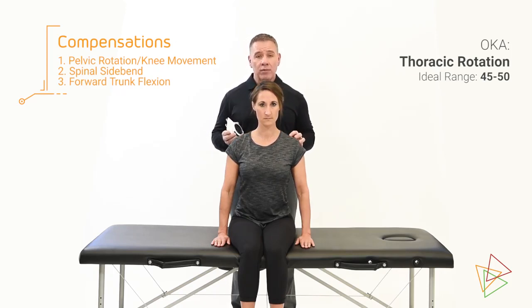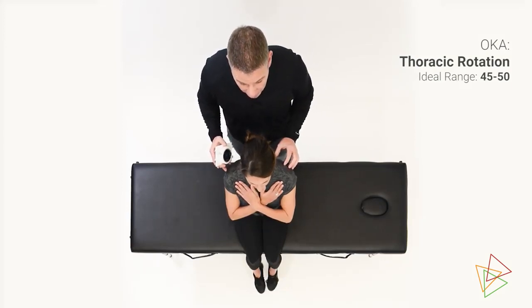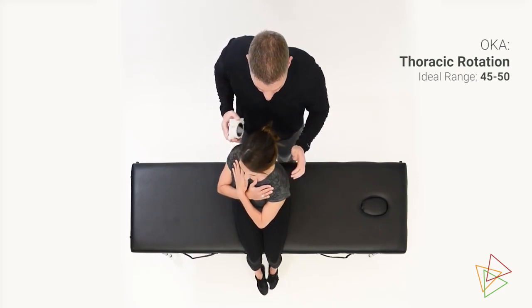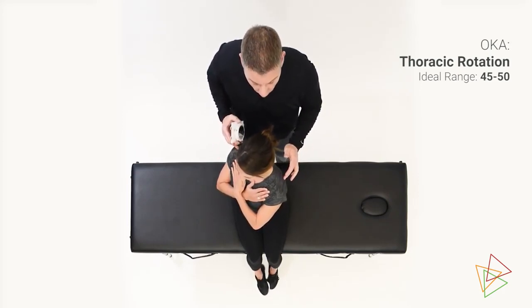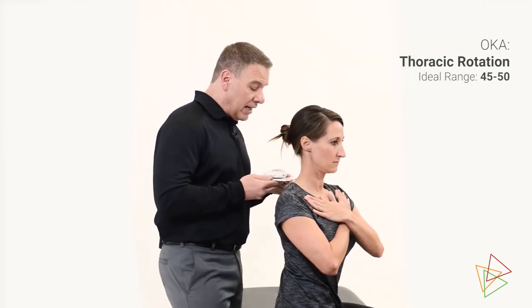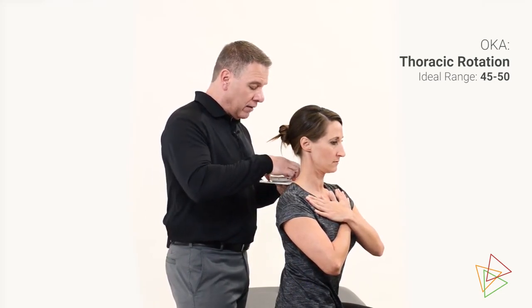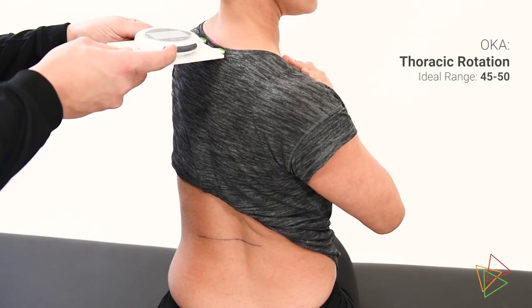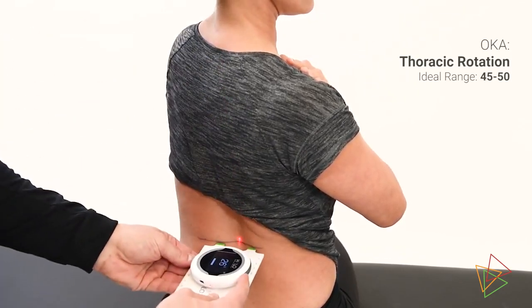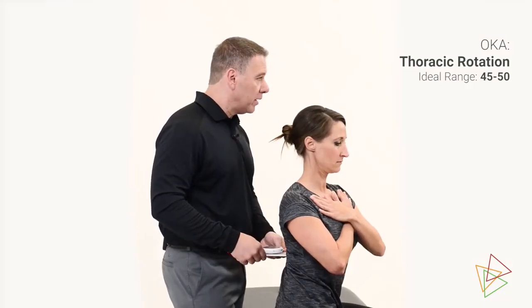We're going to have them place their arms across their chest. In this position, we're going to have them rotate slowly, keeping their eyes open, letting their head follow their rotation as far as they can go comfortably without compensating with side bending or twisting. We're going to place the prongs against the C7T1 interspace, collect our zero, move it down to the T12L1 interspace, and lock in our measurement.